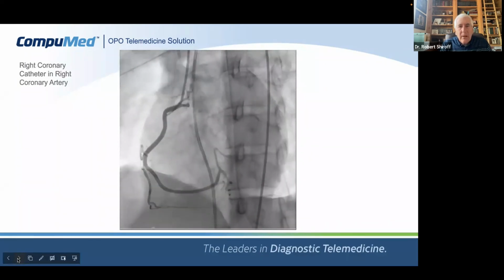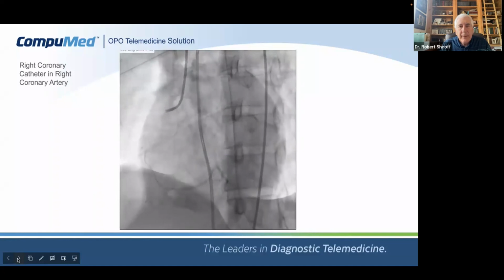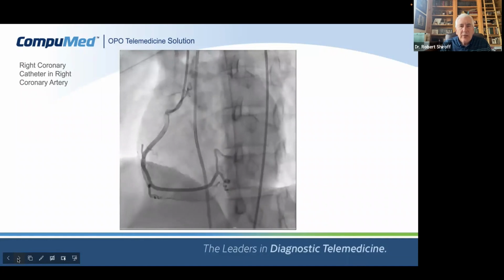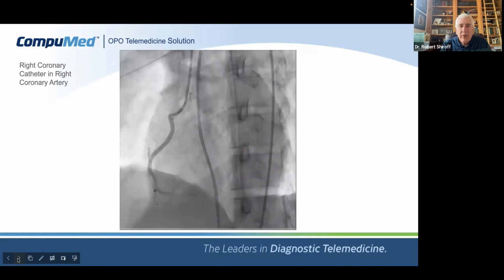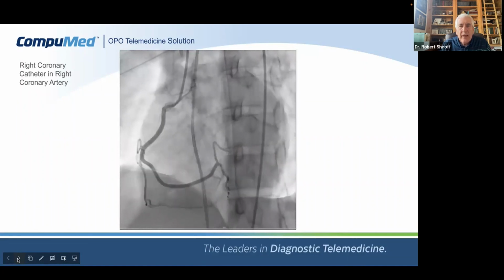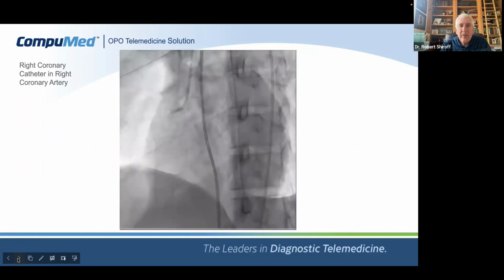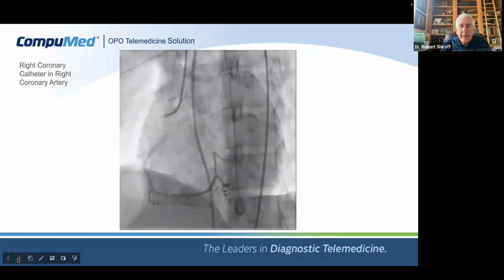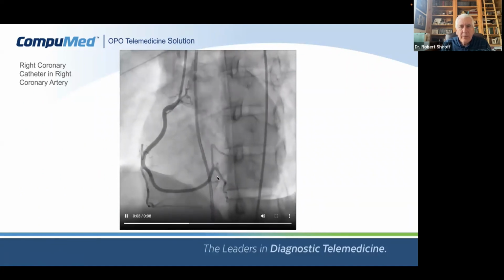And many times when we get angiograms performed in the middle of the night by a cardiologist who's not an eager player in the game, they do a single view of the right coronary and say it's normal. That's really against the rules as far as I'm concerned, because again, it's a tube, 3-dimensional. You can't see in 2 dimensions. It's the same as holding a stack of paper up against the wall and looking at it. You cannot tell how thick the stack of paper is. It could be 1 piece thick, or it could be 6 inches or 6 feet thick. You can't tell until you move around and look to see the thickness of the paper. So here's a right coronary artery. This is a dominant right coronary, which gives rise to a posterior descending coronary artery and a posterior lateral branch here.